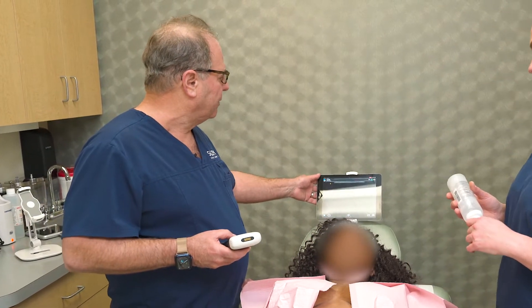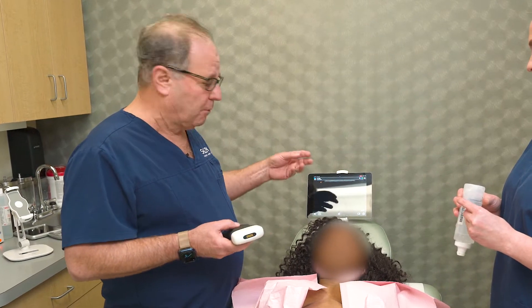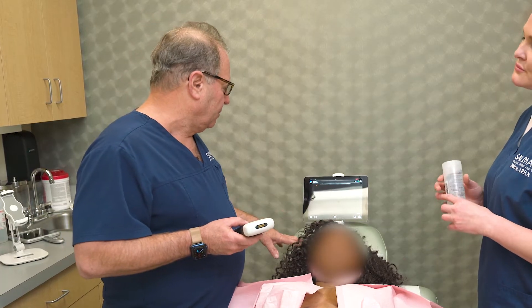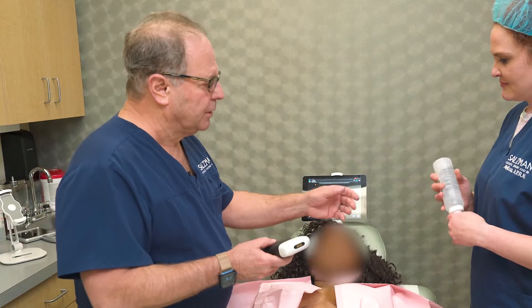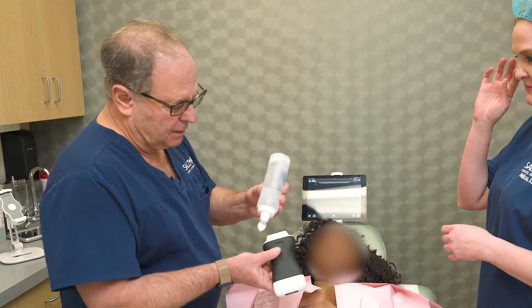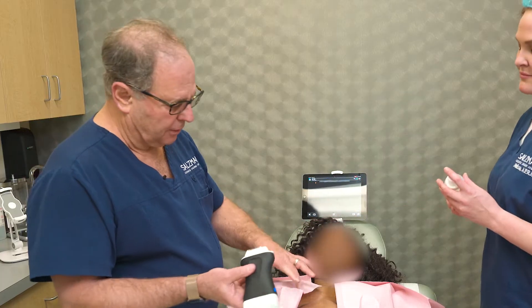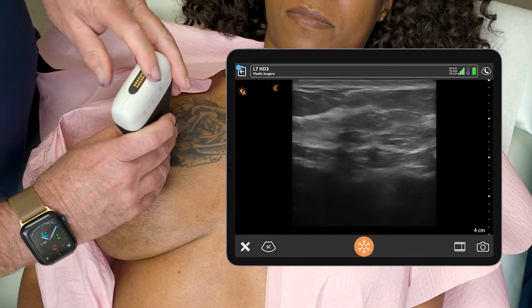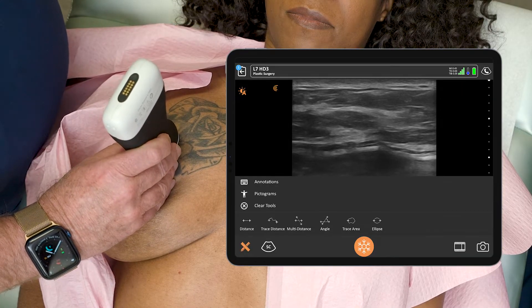I've already set this on plastic surgery, which is my preferred preset for breast exams. I've already put her name in and noted that this is a Mentor exam for a broken implant. We use a warm gel that's in a warmer, and I'll put a little bit just on the transducer. I usually start at 12 o'clock as my convention.